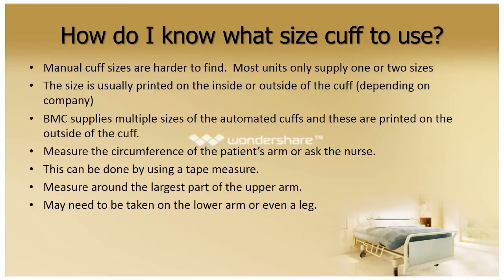Still get the same results, still get the correct results. Just be sure that you're using the correct cuff, because a cuff that is too small may give you a false elevation in your blood pressure, or a cuff that's too large may give you a false low number.